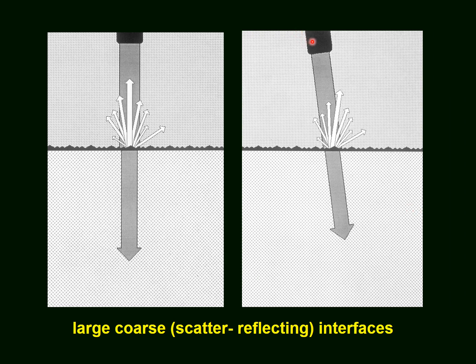And when we now angle the beam, we're not losing the echo entirely. Yes, the maximum energy is still bypassing the probe and not visible, but some energy is scattered back to the probe so that we still see an echo, a weaker one.